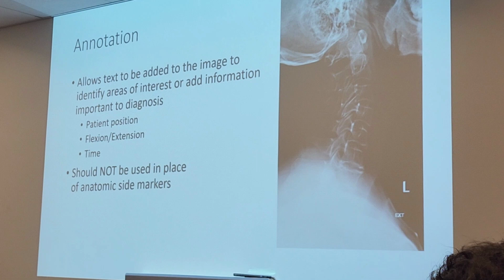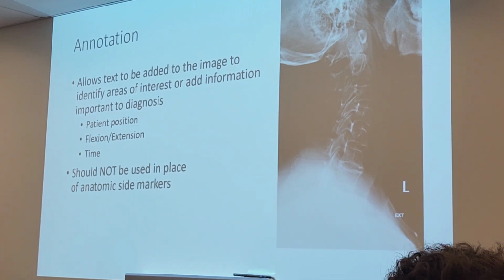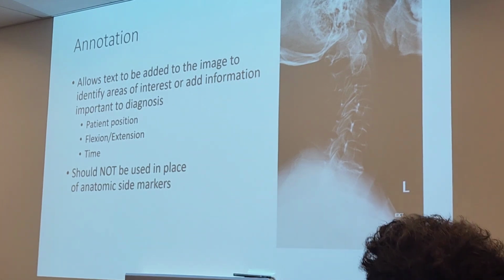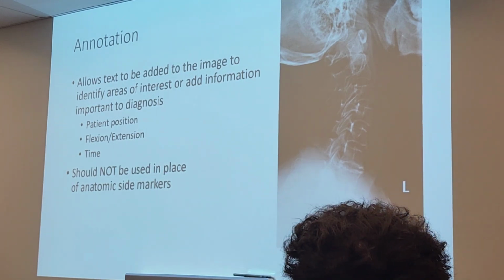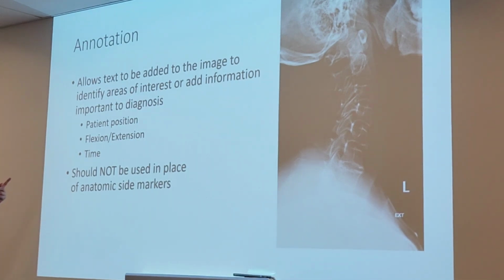In the event you clicked your marker or something happened to it, I assume you would just throw it up there to say, hey, it happened. Okay, so you can use it as a safety buffer, a backup. Let's say you do a lateral chest and your marker got burnt out. It's on the image, and if you adjust the contrast or brightness you can see it, but you just want to make it clear it's that side, so you throw on a digital left marker. As an addition, for the patient's sake. I can see an argument for that, but you can't replace it. But what else can you use it for?